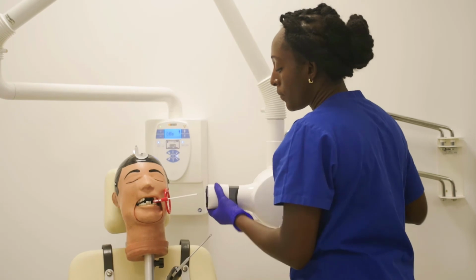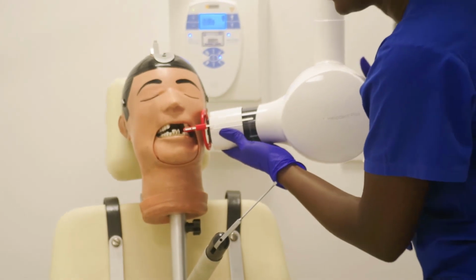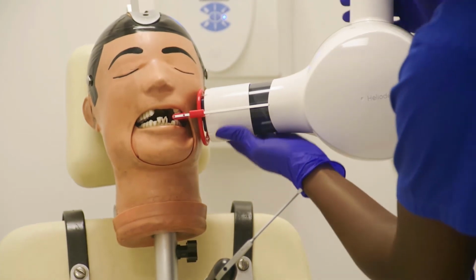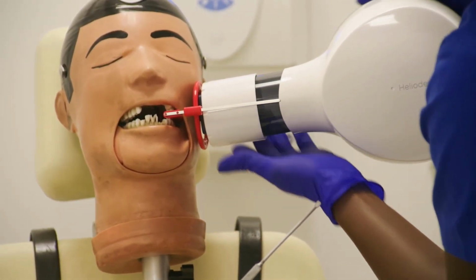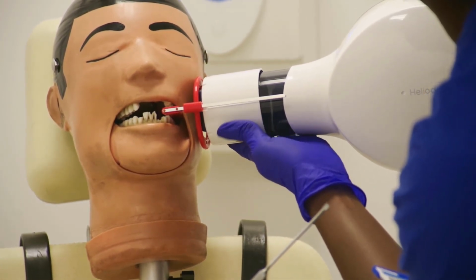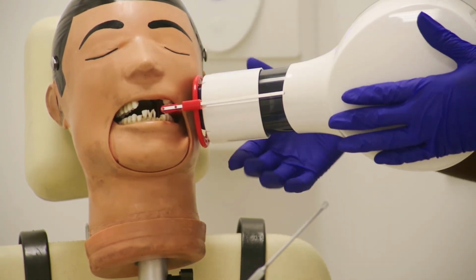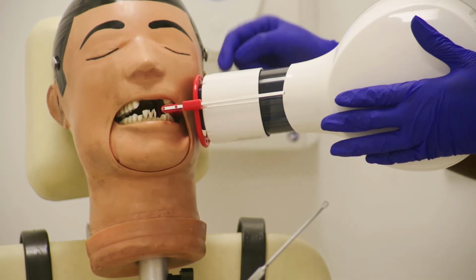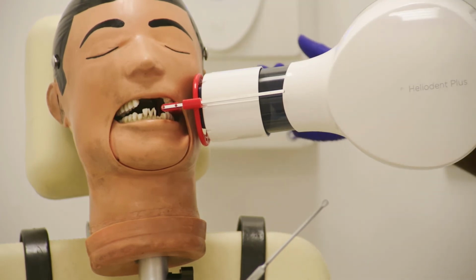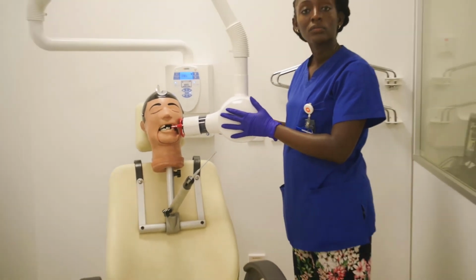So with the lining up of this particular one, it's same as you would do for posterior teeth. So you bring it in, making sure that this line is parallel to that. Okay, so that's your vertical angulation. It's still not right, so keep checking so you have it nicely aligned. Okay, and then check your horizontal as well, making sure this is aligned, and then the notches, turning the collimator so that the notches are nicely aligned. So once you've positioned, go behind the screen, press your exposure button, and then you can release it.